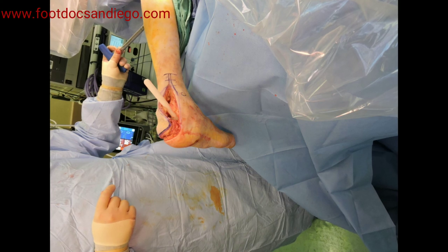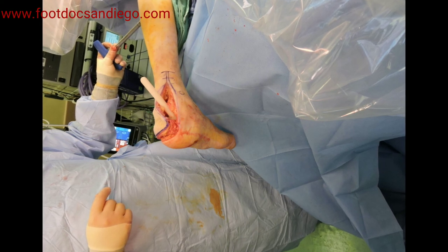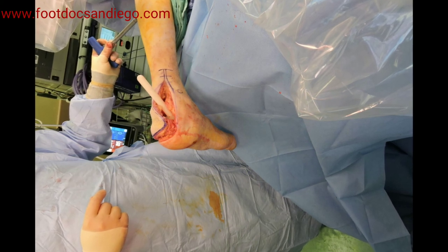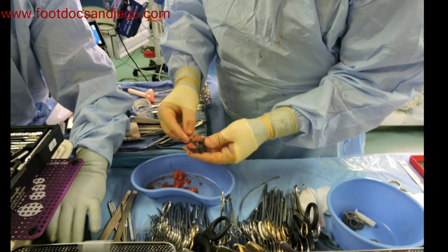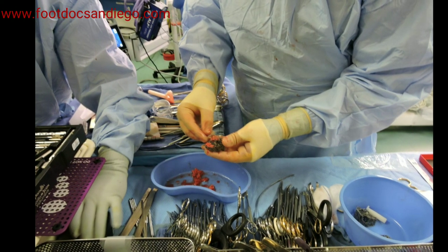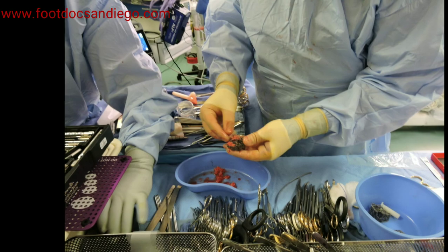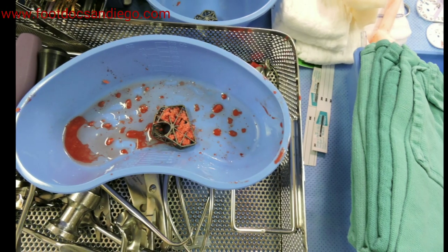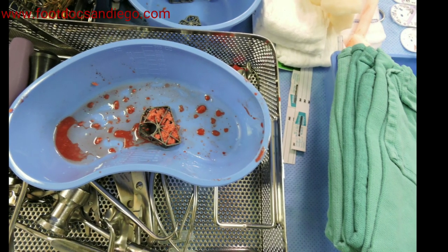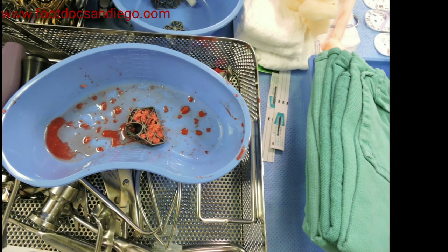Here you can see the implant getting sized in place. We are also going to be taking some bone harvests using an amazing bone harvester device called the Avitus Bone Harvester, which allows us to get bone and bone marrow from the patient's proximal tibia. You are now seeing that we are applying that bone and bone marrow into the 4web implant. You will see here a close-up of the packed bone and bone marrow in the implant — this is the patient's own live cells, as opposed to using dead bone and hoping that it will take.